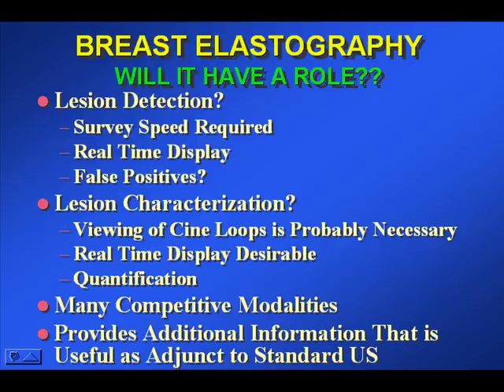The problem with breast elastography is that there are many competing modalities. You have MR, you have infrared imaging, you have advances in plain ultrasound and in mammography, tomosynthesis, all compete against ultrasound for diagnosing breast cancers. And it's not clear that elastography will emerge as a dominant player. But since it can be performed at no additional cost as part of the breast ultrasound, which is already a major component, we believe that it will be a useful addition and will gain a competitive advantage in that way.